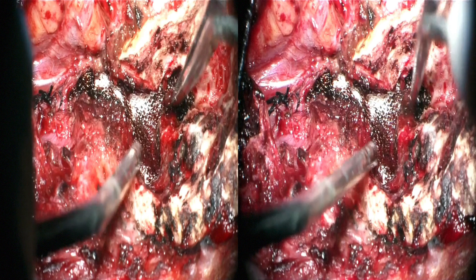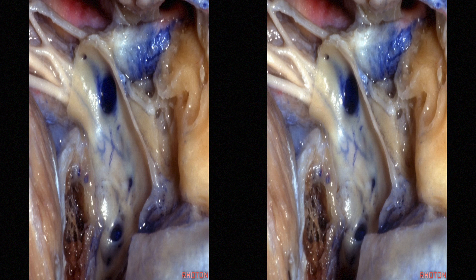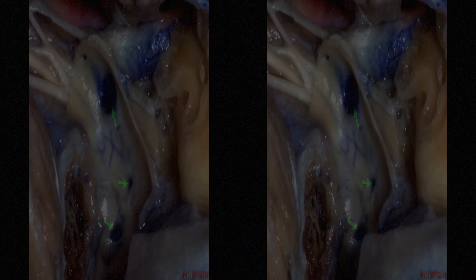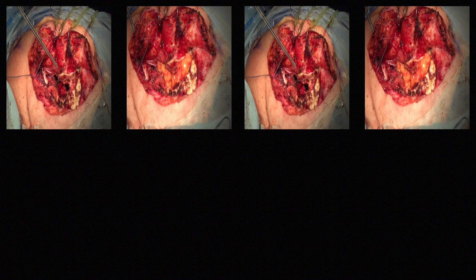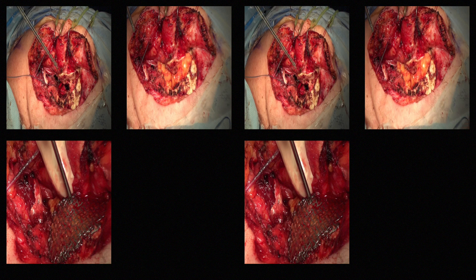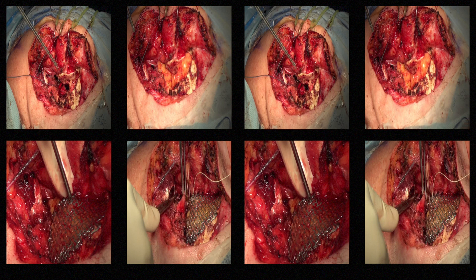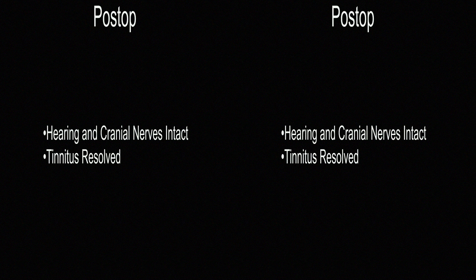This cadaver dissection in a normal specimen shows the medial wall of the jugular foramen and bulb region, the lower cranial nerves covered by the medial wall, and the venous channels representing the inferior petrosal sinus and condylar emissary drainage into the jugular bulb. Closure of the cranial defect is accomplished using a fat graft taken from the anterior abdomen, held firmly in place by a titanium mesh cranioplasty. The sternocleidomastoid muscle is attached to the titanium mesh and the soft tissue of the neck dissection is closed in a layered fashion. Postoperatively, the patient's hearing, lower cranial nerve, and facial function were normal, her pulsatile tinnitus was resolved, and a two-month follow-up MRI showed no residual glomus tumor.